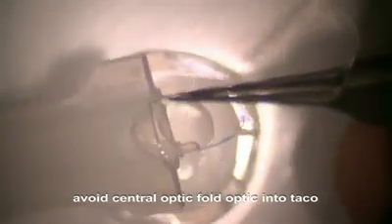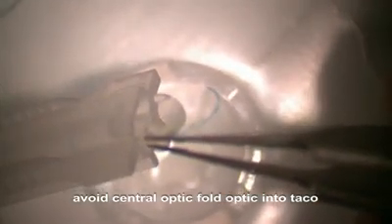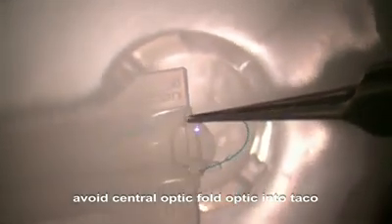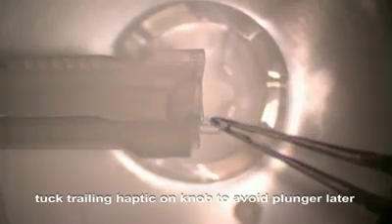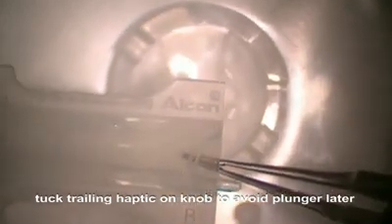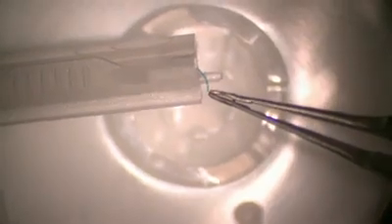We're going to be very careful not to touch the central optic. We're going to try to get this lens to fold into a TACO so that the two sides are coming up at us, and the center of the optic is down in the cartridge so that the plunger can push it forward. Now you can see that it's moving forward nicely — the optic is forming this TACO where you can see the flash as the two edges of the optic are coming towards you. Now we're going to take this trailing haptic and place it on the side of this knob, so that it will be protected by the plunger and won't get damaged.